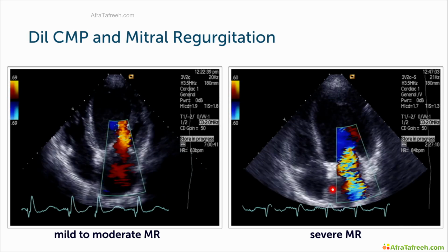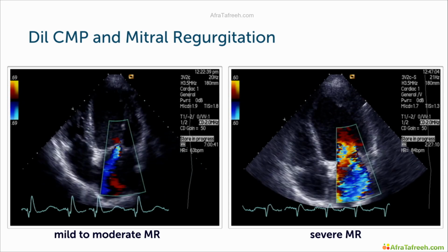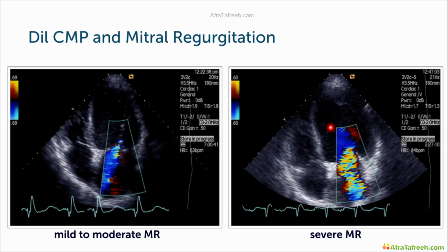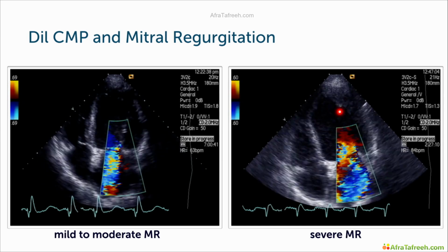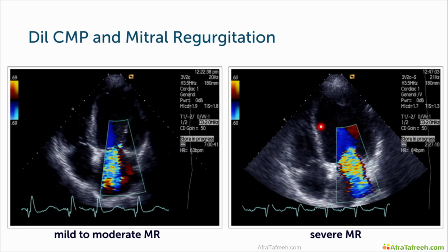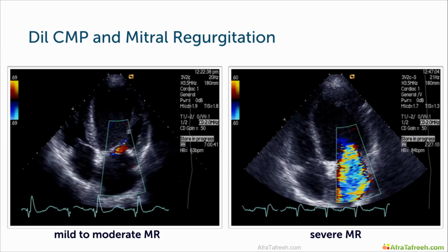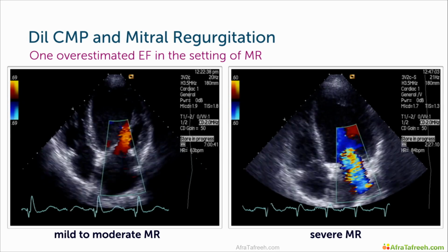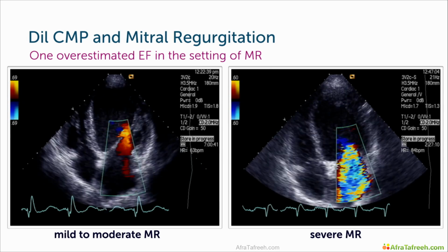The jet fills almost the entire left atrium. Now, what are the considerations here? Well, in this patient, we have a high volume overload. In other words, actually, we'd expect the ventricle to be hyperdynamic. So basically, if you look at his function, you have to even subtract some ejection fraction points to understand the true left ventricular function this patient has.